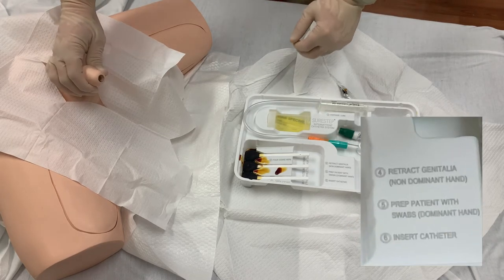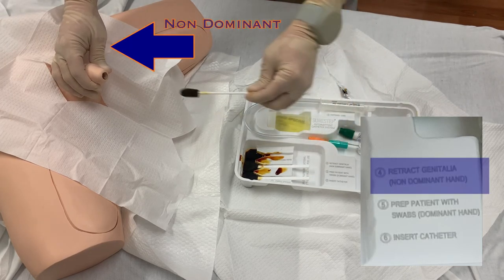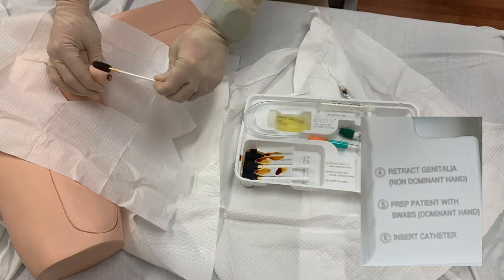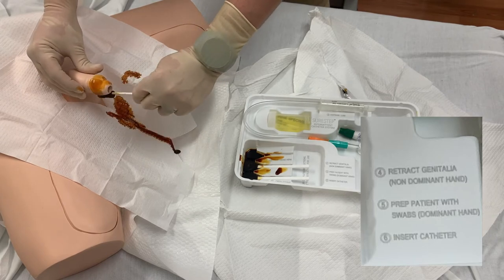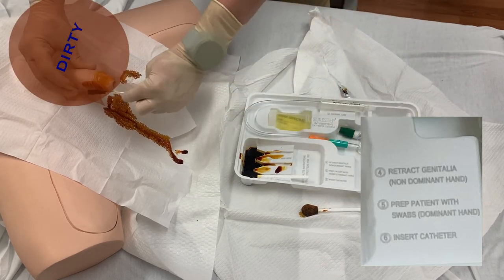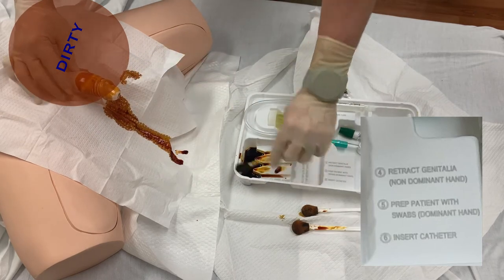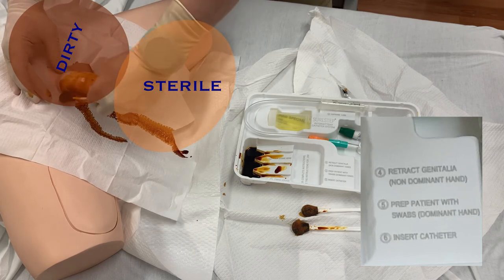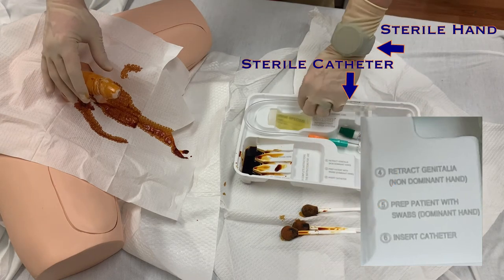Steps four, five, and six can be found below the catheter: retract the genitals with your non-dominant hand, prep the patient with the swabs with your dominant hand, and insert the catheter. The iodine should be applied to the patient in the same method that the peri-care was performed. Your non-dominant hand is holding the non-sterile genitals in place for disinfection, so that hand is no longer sterile. Your dominant hand is applying the iodine to the insertion site, and thanks to the long-handled applicators, this hand should not come in contact with the patient and thus will remain sterile. Only your dominant, sterile hand should touch any of the remaining sterile supplies, namely the catheter itself.